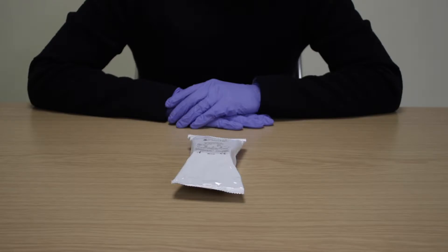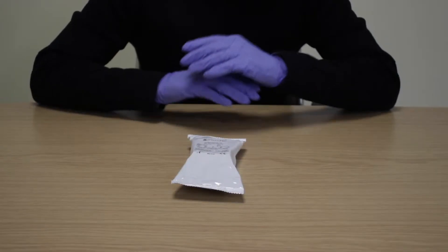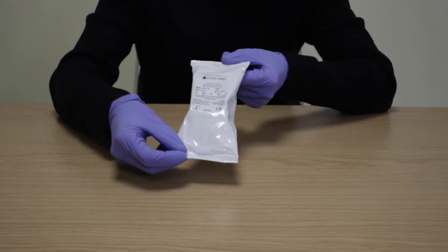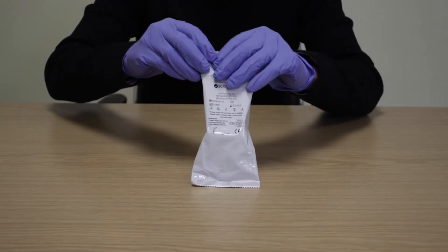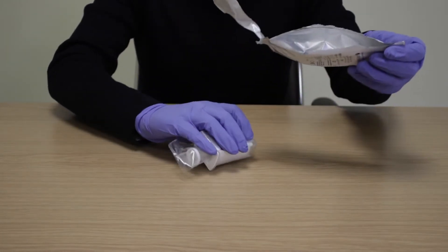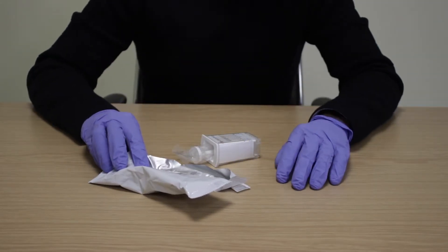Before using the ScreenPro Oral Fluid device, bring it up to room temperature between 15 to 30 degrees Celsius. Carefully inspect the packet to ensure it is intact. Do not use if opened, damaged or torn. Check the expiry date and only use if in date. Tear open the packet and remove the device and the collection swab. Place the silica desiccant pouch to one side.